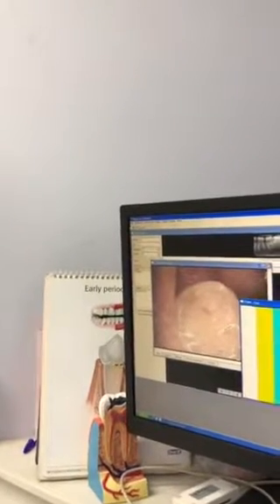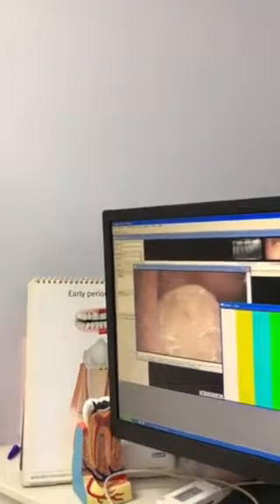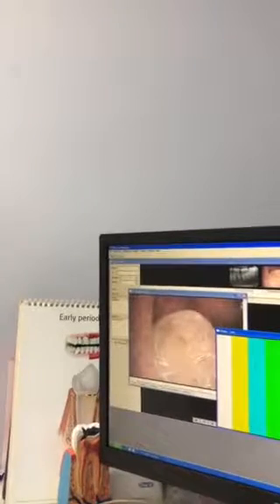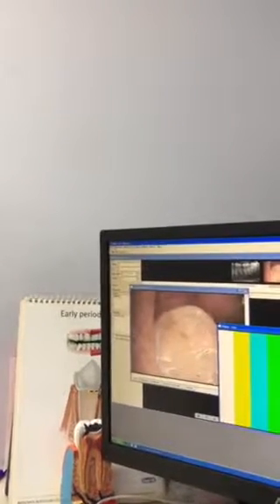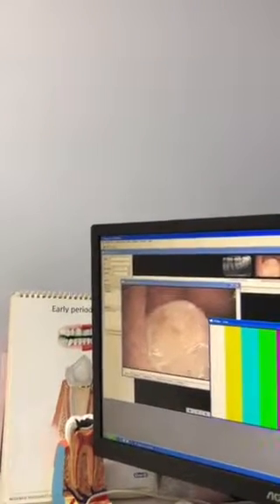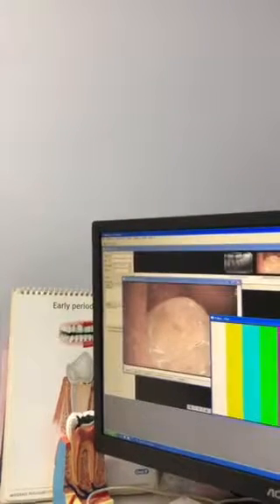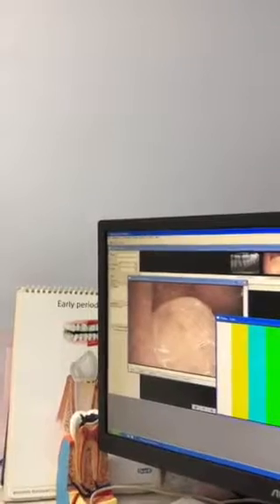Most dental practices will be referring to imaging centres to have a CT scan. The dosage of X-ray has come down significantly, so for planning implant cases, it's almost become a prerequisite to plan most cases, and that's a very useful tool when planning the implant cases.